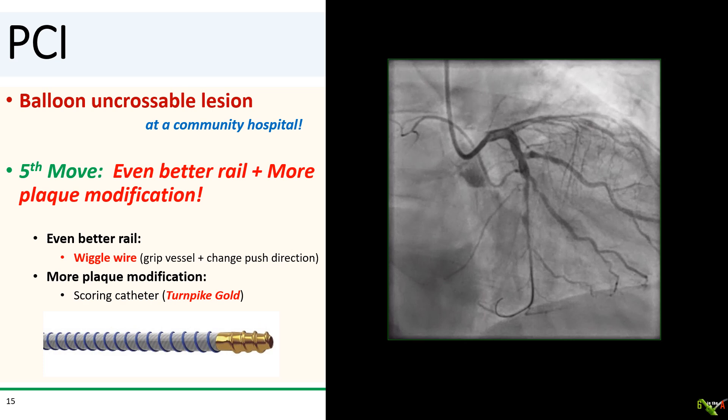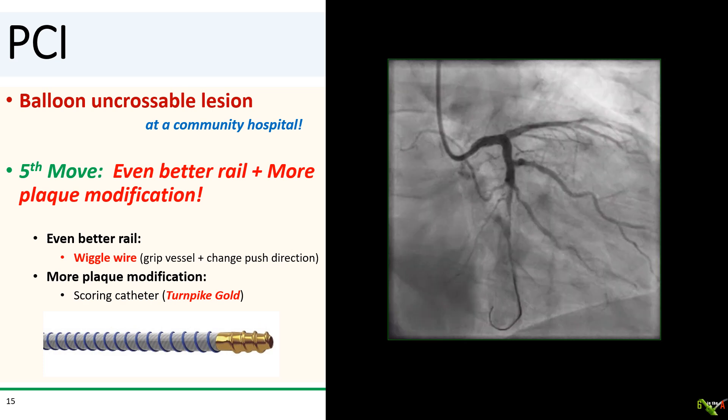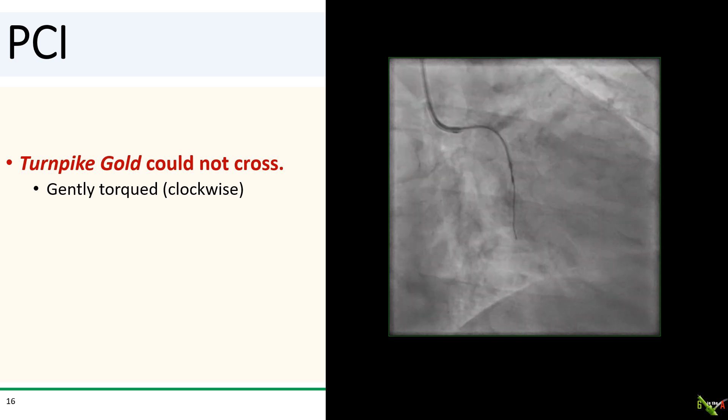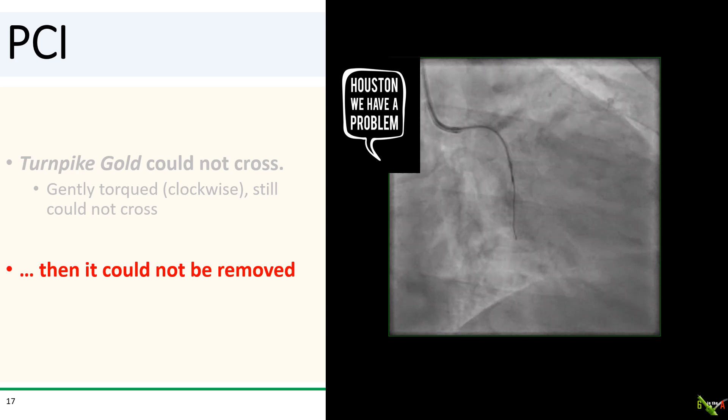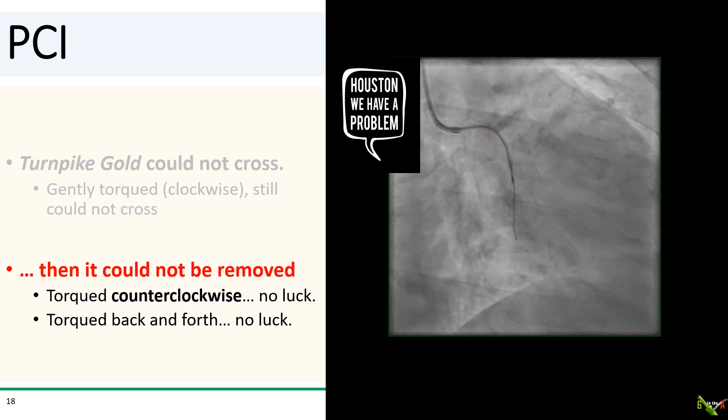So we decided to try to get an even better rail and do some more plaque modification. I wanted to switch the BHW wire out to the wiggle wire, and my plan was to use the Turnpike Gold microcatheter to do the exchange so that at the same time we would slightly score the plaque while exchanging the wire. Unfortunately, the Turnpike Gold catheter could not cross — not particularly surprising since the Turnpike LP didn't cross either. So I gently torqued the catheter clockwise at the lesion. But then I could not remove the catheter. I torqued it counterclockwise to unwind it, but no luck — it would not move. I torqued it back and forth clockwise and counterclockwise. Still no luck. It was stuck.